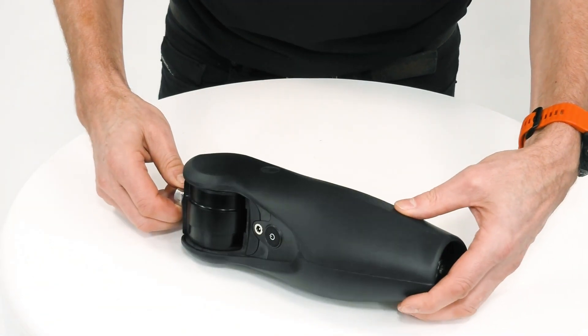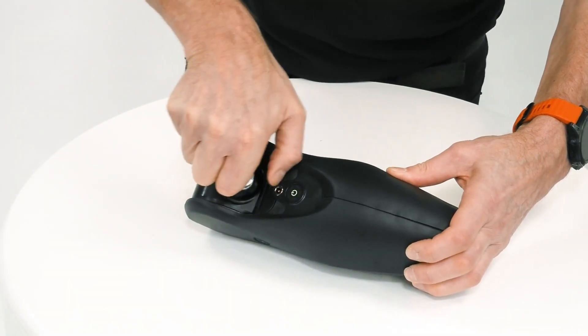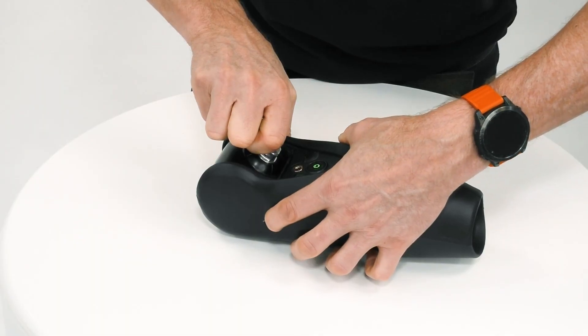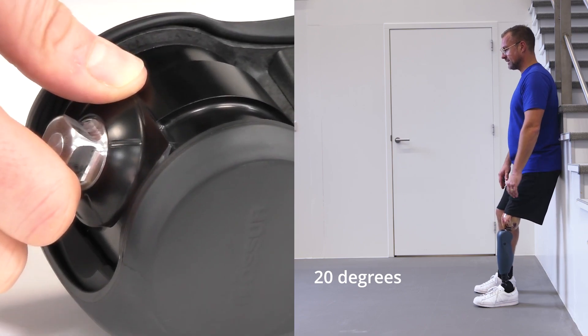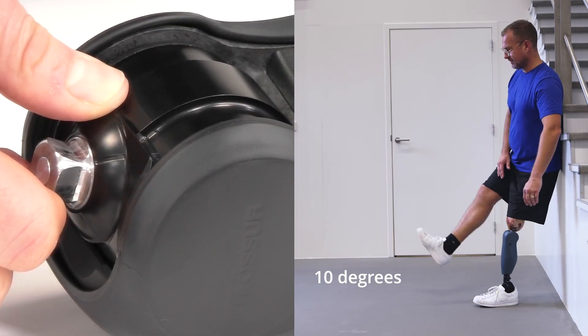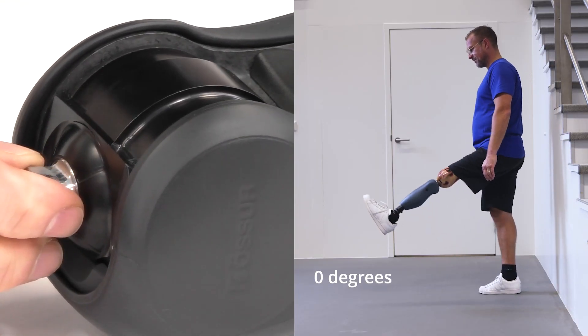In addition, there is a mechanical lock — a mechanical override. When we engage the lock by pressing the button on the side, we have a three-stage lock mechanism: at 20 degrees the lock holds in position, then at 10 degrees the lock holds there, and then also fully extended — the lock is fully engaged.